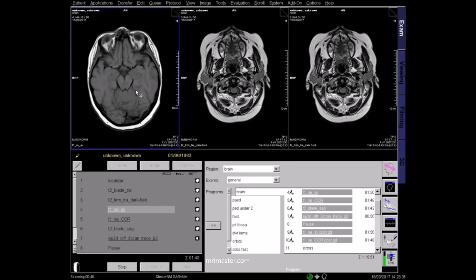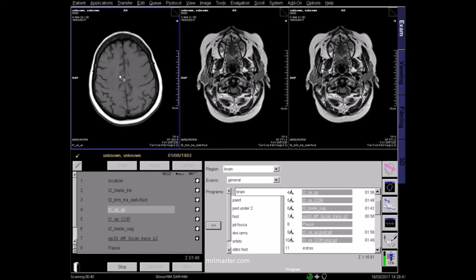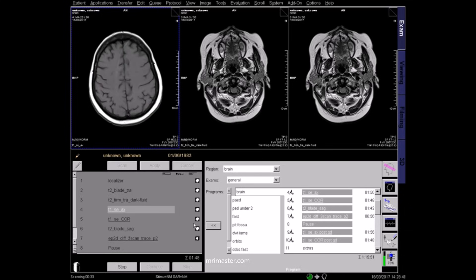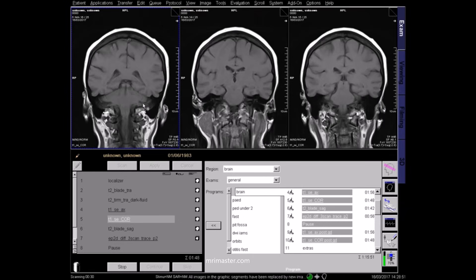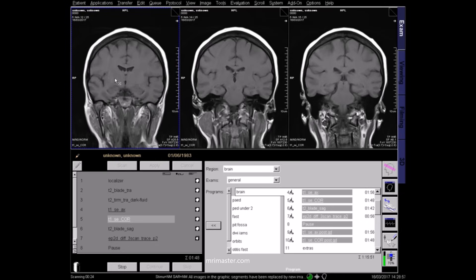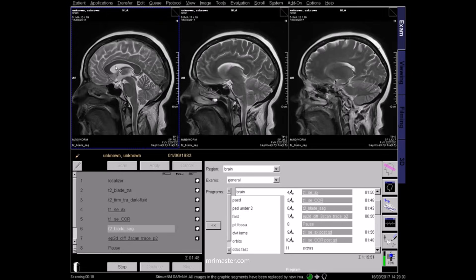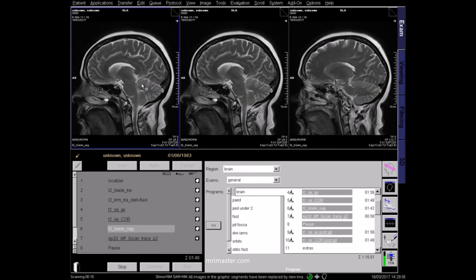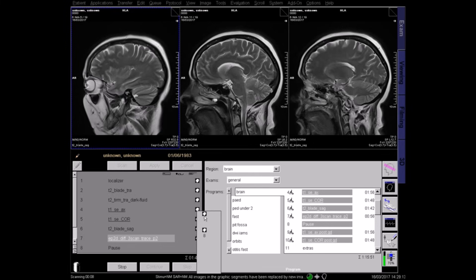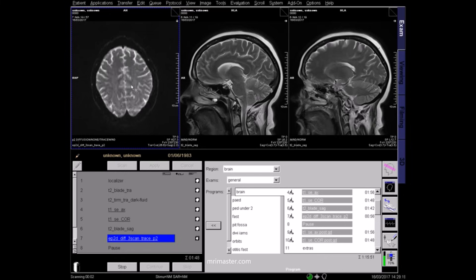On the T1 sequence, fluids appear dark, fat is bright, and most pathologies will appear dark. This is a coronal T1 sequence. This B0 diffusion scan sequence looks quite similar to a T2 because the diffusion value is 0.